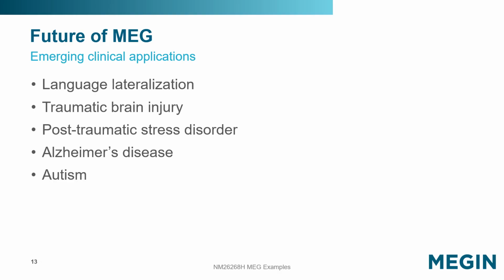The emerging applications are highly exciting and will provide new opportunities for MEG studies in clinical settings for language lateralization, traumatic brain injury, post-traumatic stress disorder, Alzheimer's disease, and autism.